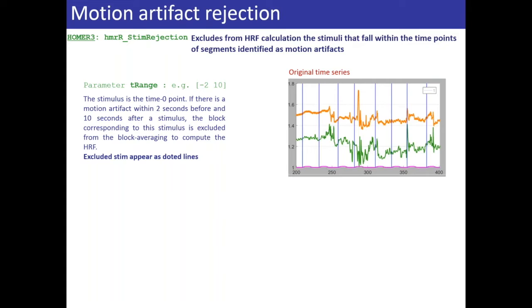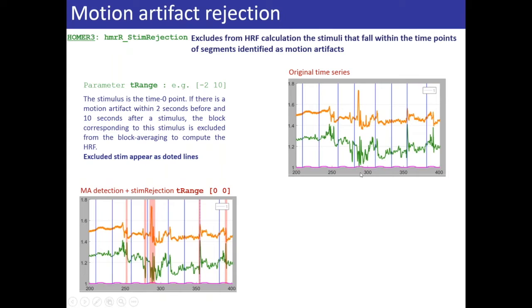So here we have this signal, orange and green, 2 different fNIRS channels. And we have these huge motion artifacts. It's like a large spike here and like small ones elsewhere. And when we apply the stim rejection function, and if we put tRange 0 to 0, it will show the motion detected signal. You can see the motion artifacts here again in red patches, but there is no trial excluded. Each of these blue lines is a start of a different stimulus. So none of them are excluded, except this one, because the motion artifact is actually on top of the stimulus start.